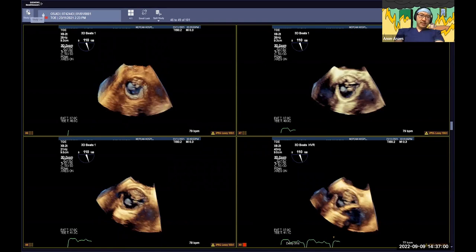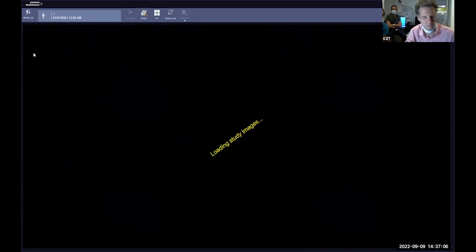Sam, is there any deep gastrics on this paper? No. Sorry, I'm just going to have to pause the screen share, excuse me. What are you looking for on the deep transgastric? Well, there's just so much. We're saying it's infection until proven otherwise, which might be reasonable in the absence of clinical history, but depending on whether it's metal or bioprosthetic in this man, it could be pannus, it could be thrombus. The motion obviously is concerning for regurg, but there's so much dropout around that graft and everything, and we did see something. I'd expect in deep transgastrics to get a better idea of what was going on. You could line it up, you could see if he had stenosis or regurg, etc. But if he had any deep transgastrics, that might be nice.